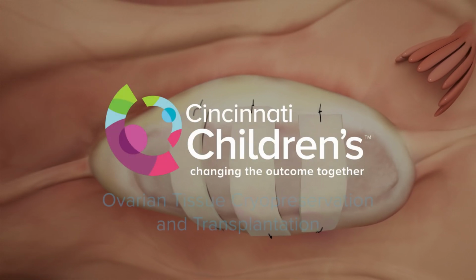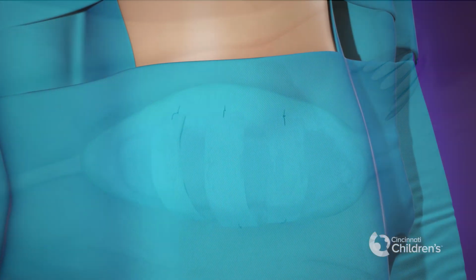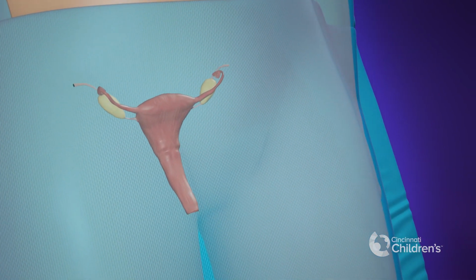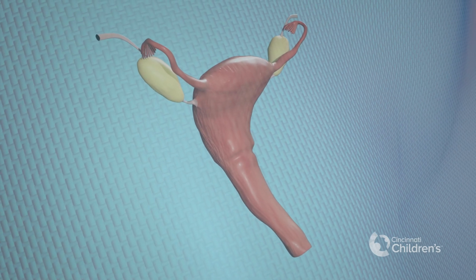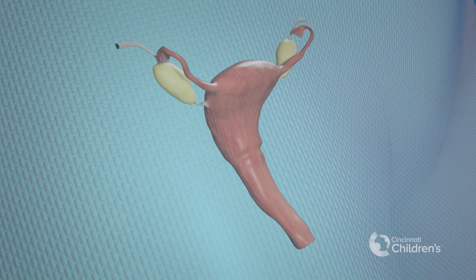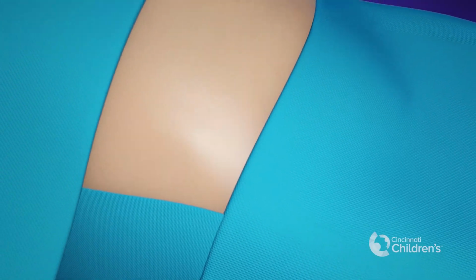Ovarian tissue cryopreservation and eventual transplantation are procedures used for fertility preservation in patients of all ages receiving high-risk gonadotoxic therapies. This video reviews the different surgical procedures that can be used to perform ovarian tissue cryopreservation and transplantation.